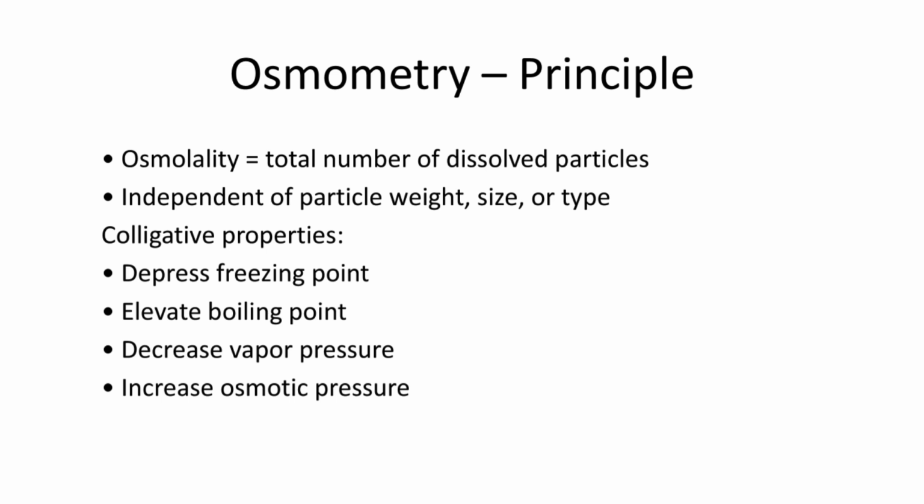The molecular weight, size, density, or type of particle does not matter. Only the number of particles counts. Any dissolved substance will change the solvent's physical properties, called colligative properties. These include depressing the freezing point, elevating the boiling point, decreasing vapor pressure, and increasing osmotic pressure.